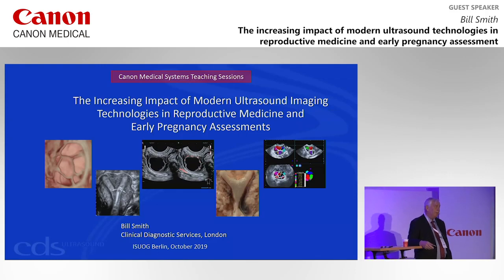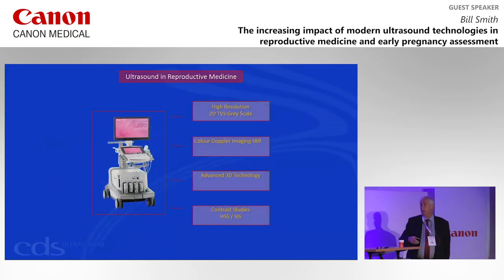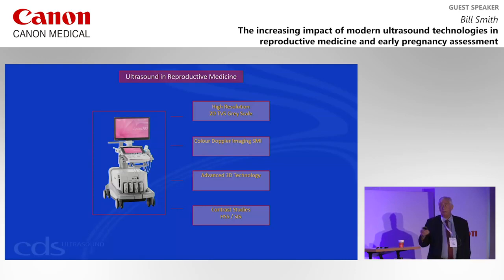I don't think it's unreasonable to say that modern ultrasound is very underused, not fully utilized in gynecology, but in particular in reproductive medicine and early pregnancy. I think we kind of look at the basic formats that we have available to us. And this applies to all machines.